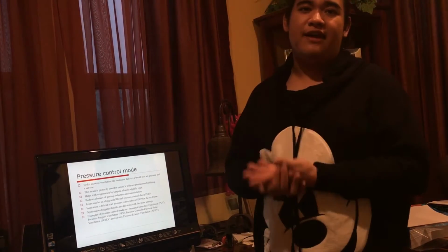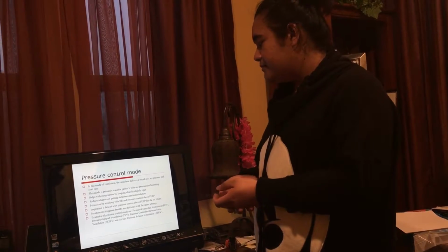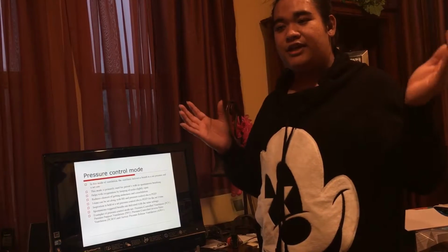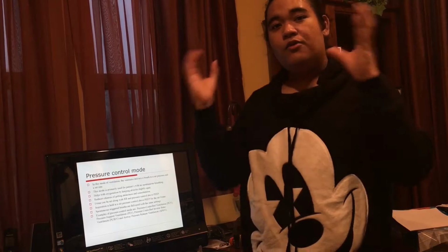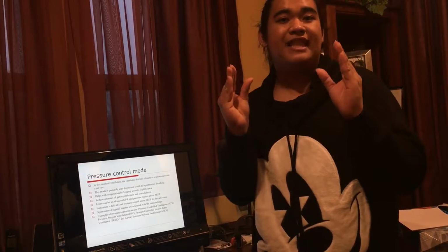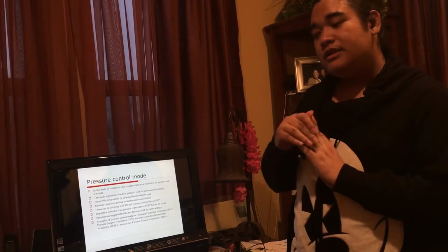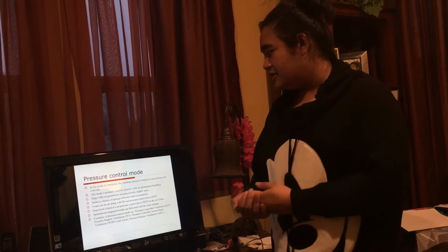Let's say 5, because 5 is a normal PEEP level. So if we put that PEEP in there, when the pressure ends and we go into exhalation, the PEEP of 5 will stay on the lungs or the alveoli and will keep them slightly open. That also decreases the chances of patients having atelectasis, because it's keeping the alveoli slightly open. It will also improve, as I said, the oxygenation.